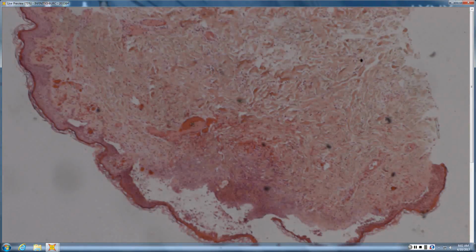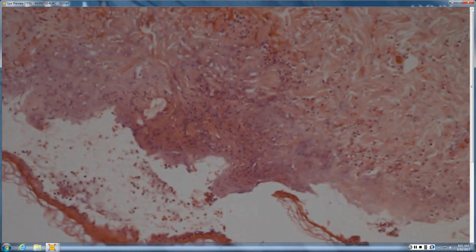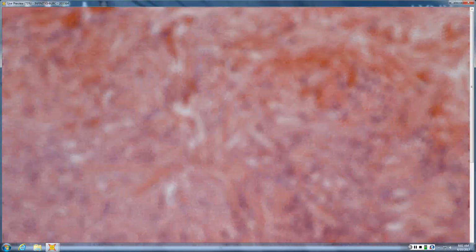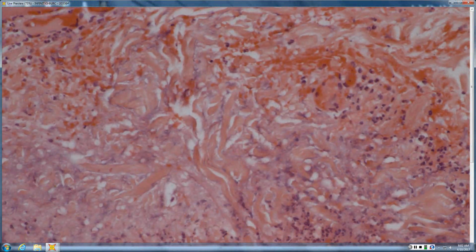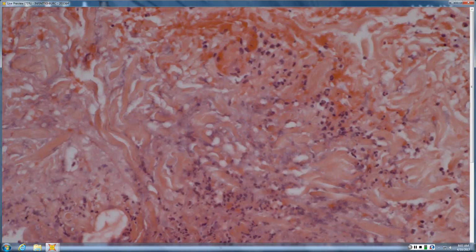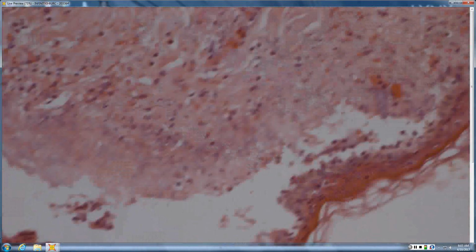So there's definitely some separation of the epidermis. Looks real, so it could be in the vesicular bullous category versus secondary. Yep. And it has kind of an acute look, which would raise the possibility of fixed drug or EM. And then you'd look at the infiltrate. It could be impetiginized, given the polys, or fixed drug or EM, which would be more likely to have neutrophils. Neutrophils, probably in fixed drug. EM tends to be only lymphs, so either EOs or newts would go more for fixed drug.